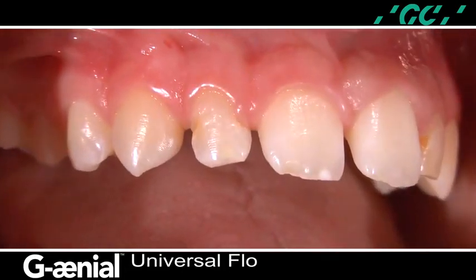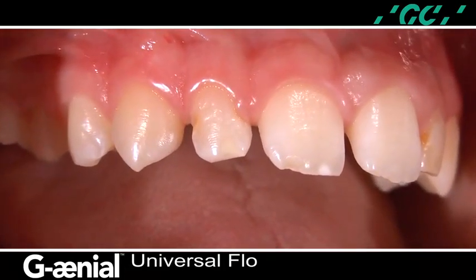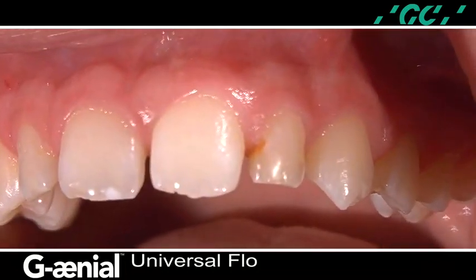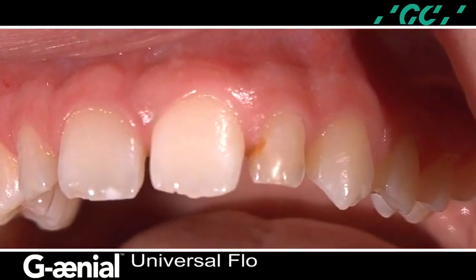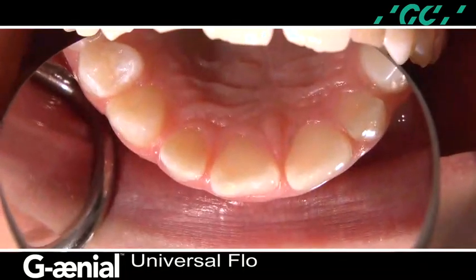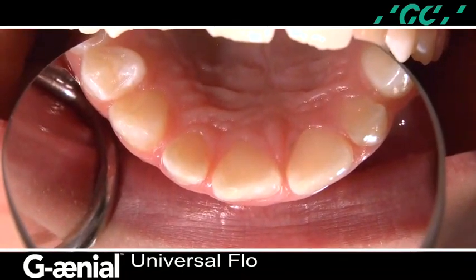It is important that the appropriate and anticipated result be decided prior to the placement of the orthodontic appliances. This enables the orthodontist to position the teeth in a way that will facilitate the desired restorative treatment with a minimal preparation requirement.